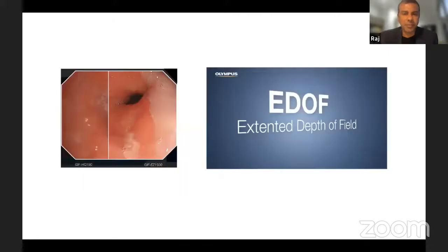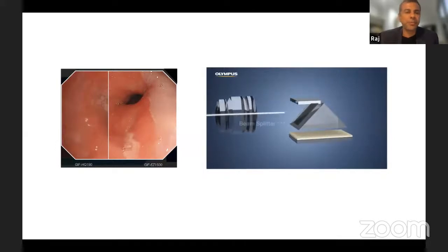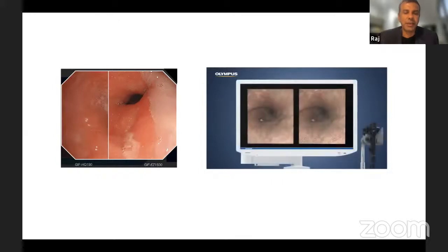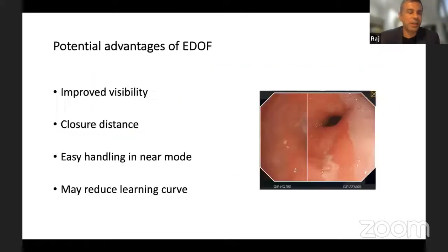The magnification levels have been quite extraordinary, actually, and the ability to visualize vessels just gives one a totally different view of the ability to predict histology. So these are the two functions which I can see with this new processor. And again, it will be subjected to further study to see how effective or how different it is compared to the present systems which are available.